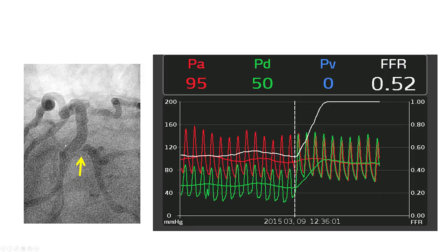Physiologic assessment can be done before or after PCI. This is an example of crossover stenting from the left main into the LAD, jailing the circumflex which has a lesion. Performing physiologic assessment — this is FFR with pullback — shows a significant step-up at the origin of the circumflex, suggesting this lesion is significant and requires further treatment.